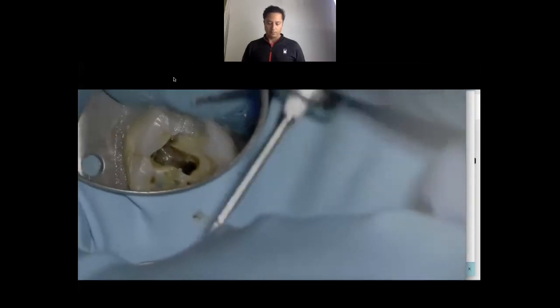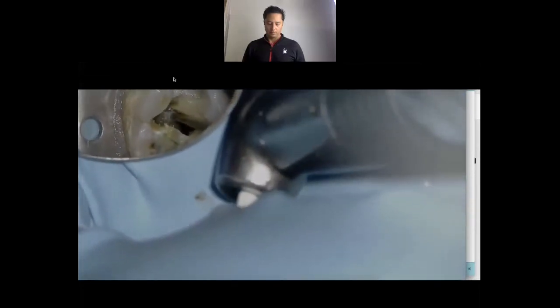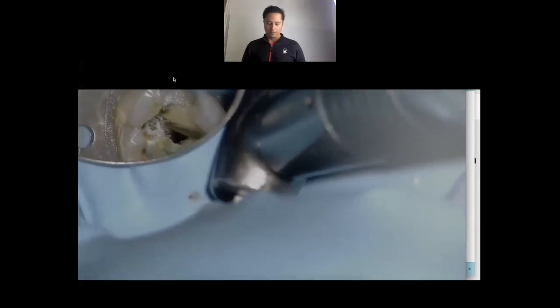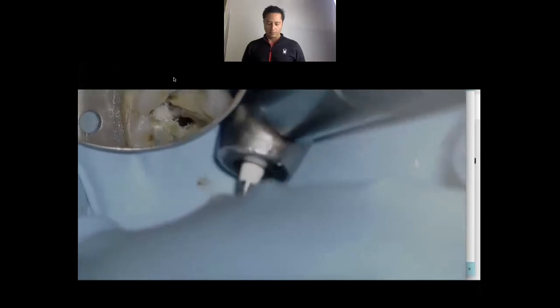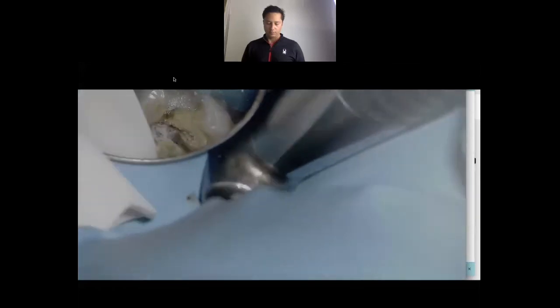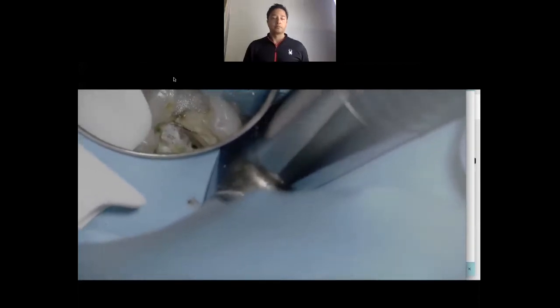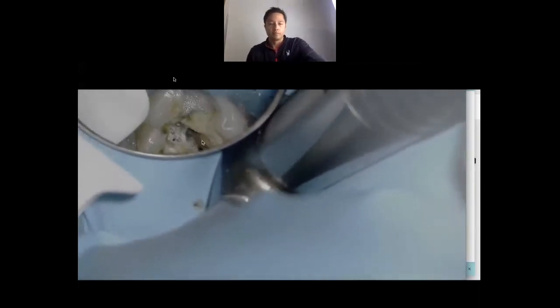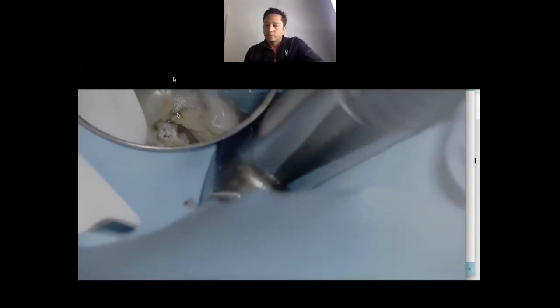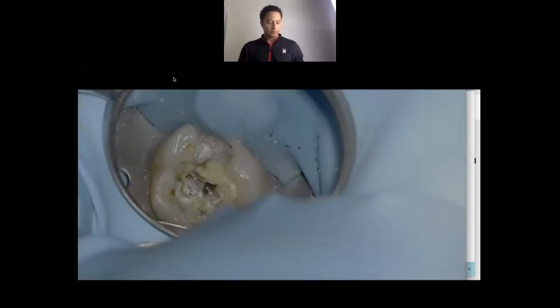I'm going to take my Muntz bur and literally just brush away the dentin in that spot — you're going to see a little white dot show up. I'm doing a nice light brushing technique and moving it towards the mesial. Instead of using ultrasonics, I'm using round burrs. The debris from the dentin actually collects into that little orifice. So what I'm going to do now is take a six file and see if we get any engagement.